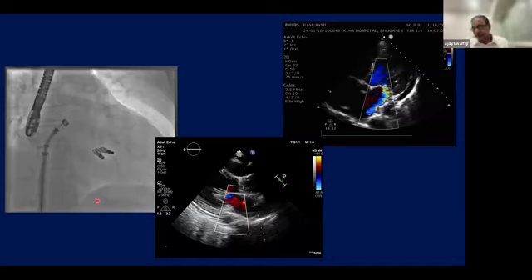I think this will require 2 clips. I think 1 clip might be enough. I think I will do an A2P2. And I think I don't need an oblique clip, or I will plan to put it that way, etc.